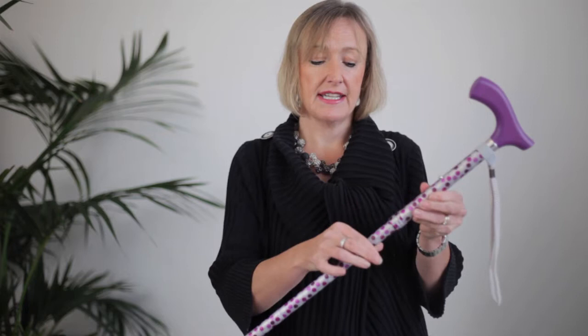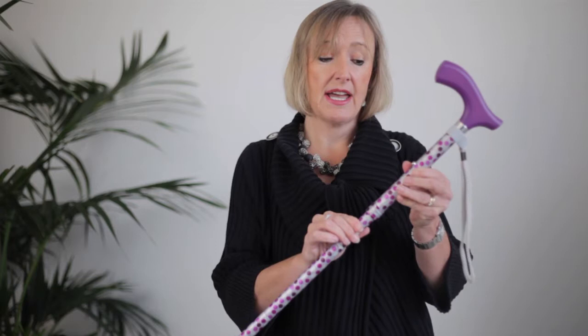Once you've got it to the right height, you must tighten the safety locking band. It's a feature whereby, once it's tight, even if you catch the pin — which is very unlikely — the stick height will not alter. It's also important because it will stop it making a noise when you walk along, you know that horrible clicking sound that some sticks make.